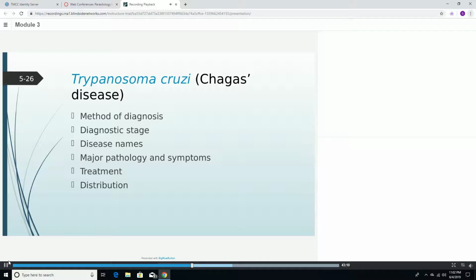Excuse me. So whenever a patient's experiencing a spike in their fever and other symptoms that are being exacerbated, that's whenever we're going to want to take a blood sample and make a smear. And again, we're going to want to make a thick smear slide for this organism.